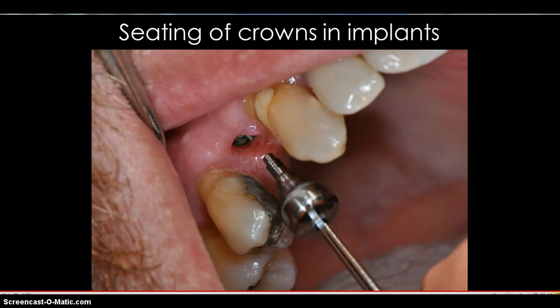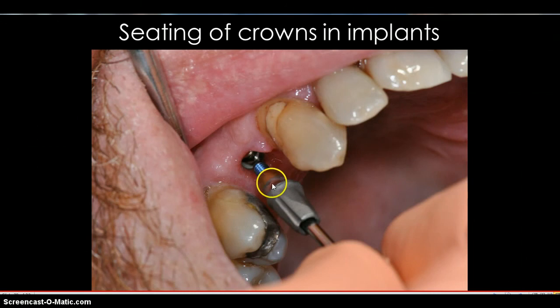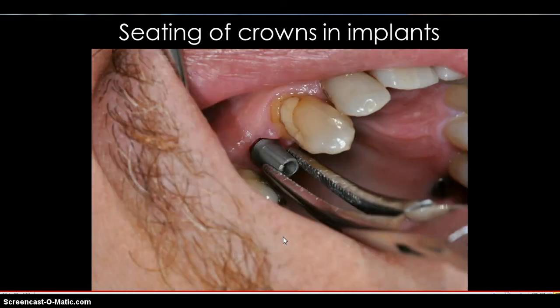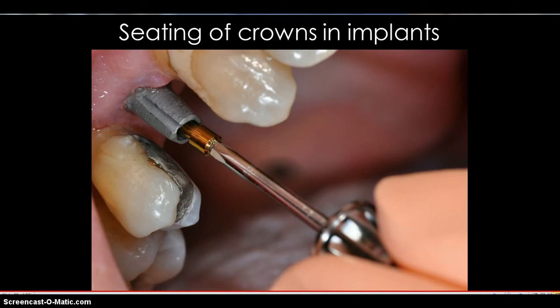So we're going to take off the healing abutment. You can see clearly the internal aspect of the hex and the Morse taper of the implant itself, as you can see here. Here's the abutment being seated with your blue lab screw in place, and there you can see the facial orientation. There you can see the abutment being seated with some hemostats put into place, and then the blue laboratory screw taken out, and then your gold final patient screw being placed.